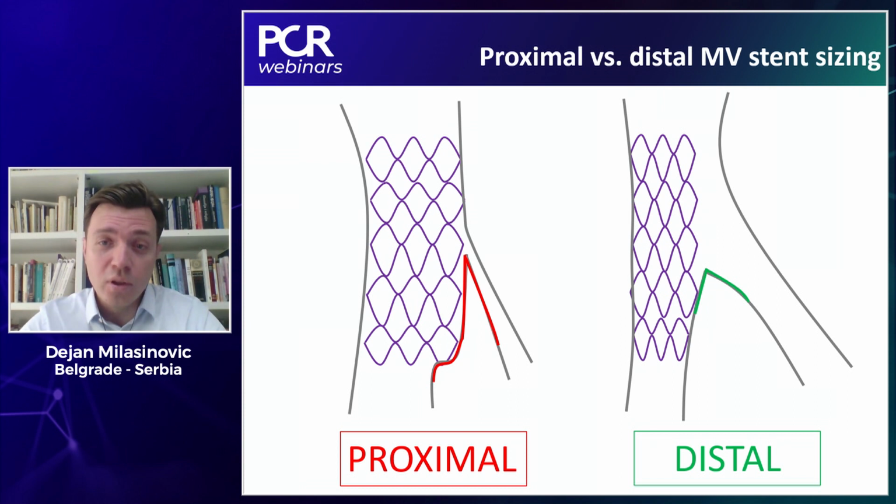What we should do is not underestimate provisional. As you will see throughout this webinar, there are several pitfalls, several procedural mistakes that we can make while performing provisional that we should really try to avoid, and if they happen, we should try to correct them.